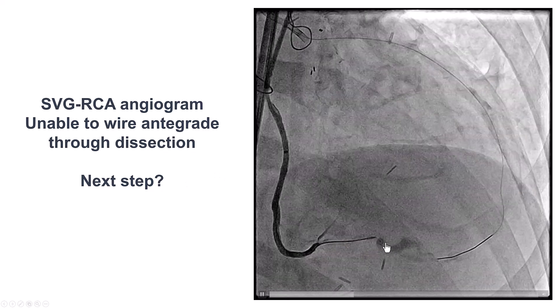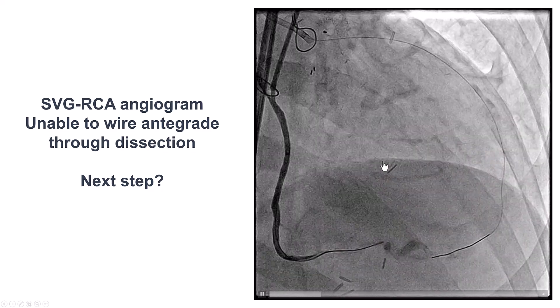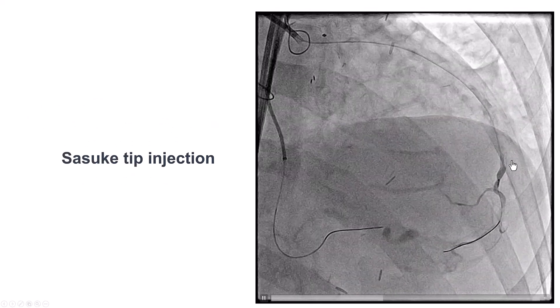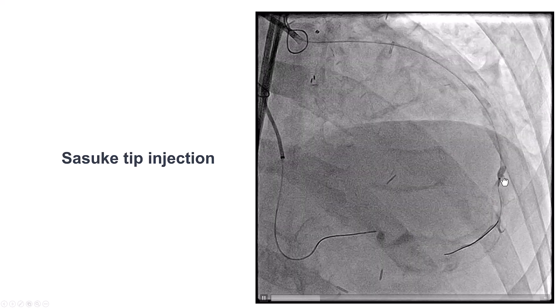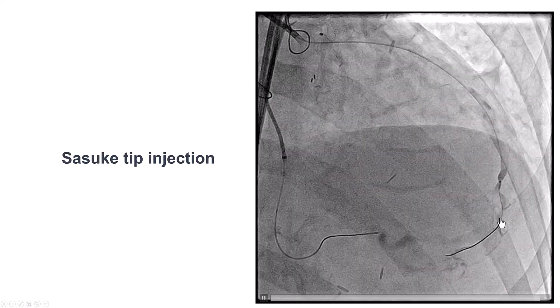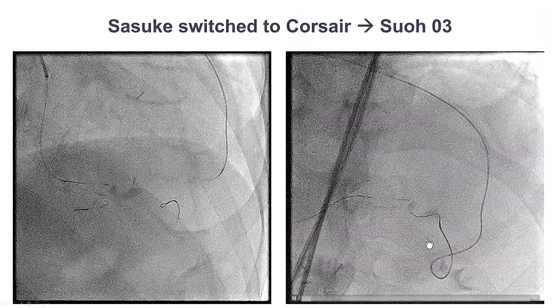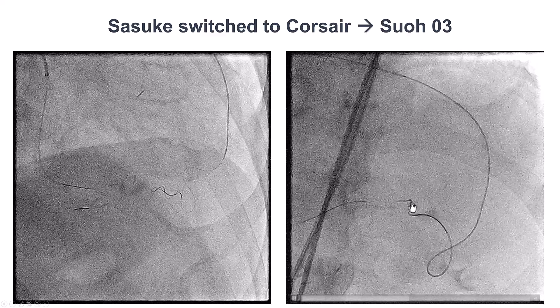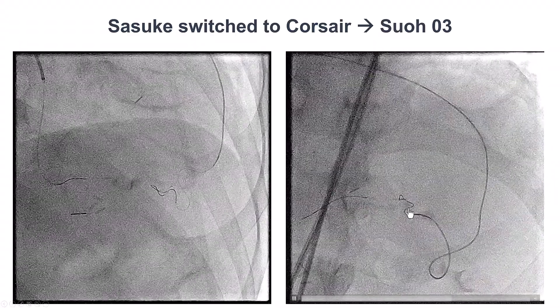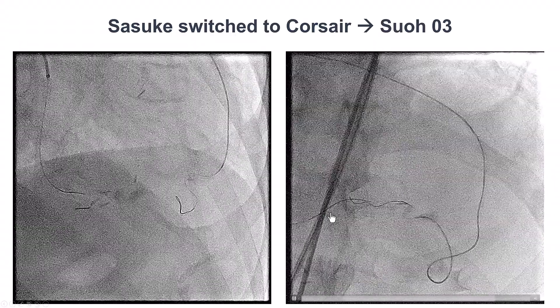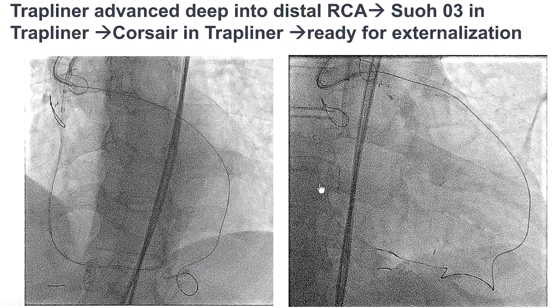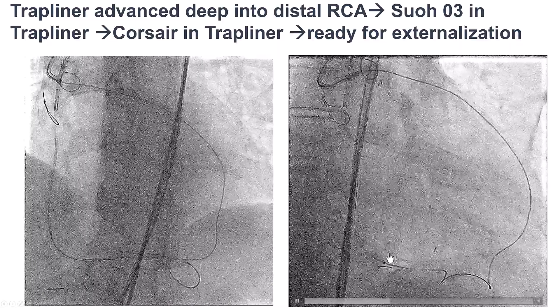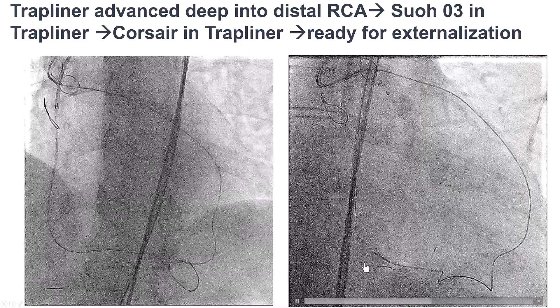So what to do? Acute vessel closure, unable to wire antegrade. Emergency bypass is an option, but with a prior bypass patient this would be hard on an emergent basis. We decided to try a potential retrograde approach. We did an injection through a Sasuke to visualize the collateral from the LAD into the RCA. There was a tortuous epicardial collateral. After changing to a SUO3 guide wire, we were able to advance the wire into the distal RCA close to the antegrade microcatheter. The SUO3 eventually crossed into the proximal true lumen. We then advanced an antegrade guide extension — a Trapliner — further distally, and were able to get the Corsair all the way into the Trapliner.